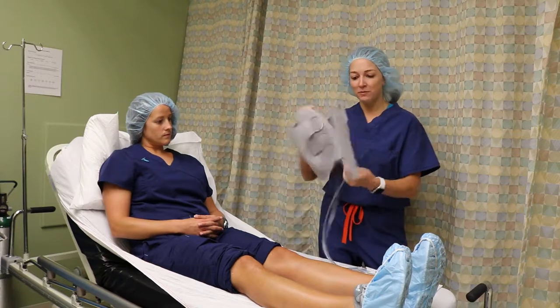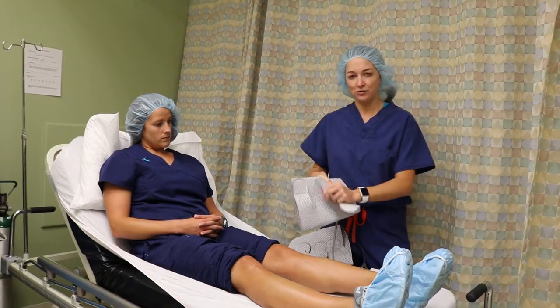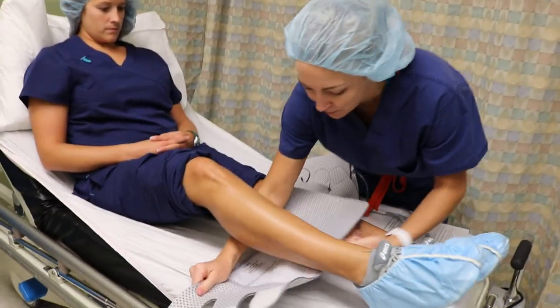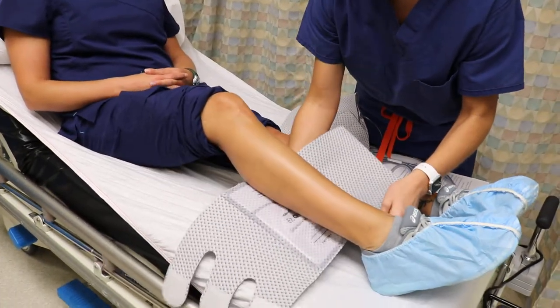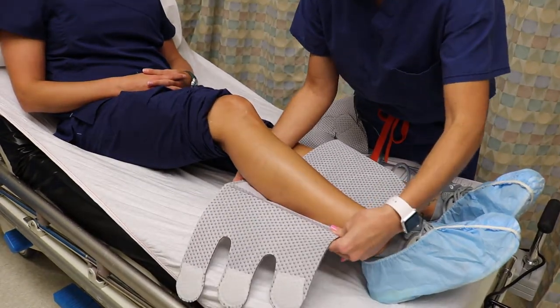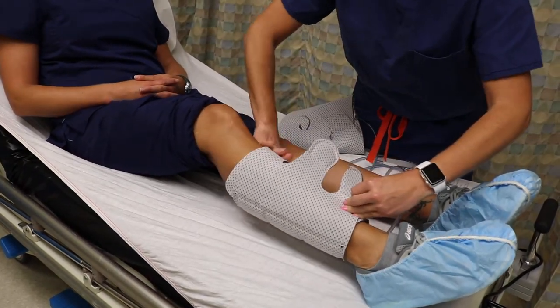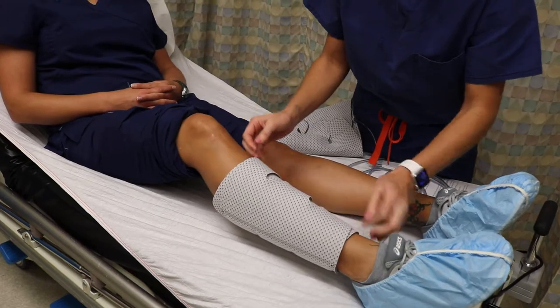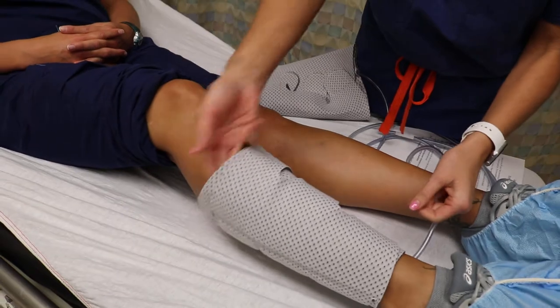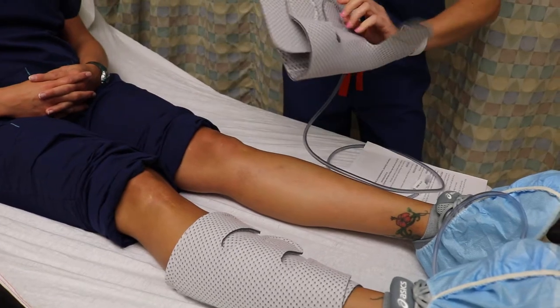It comes with two — does not matter which one goes on which leg. You simply un-Velcro the three Velcro tabs. You put the leg right on, calf up here — the wide part to the top of the calf, bottom towards the ankle — and you simply just wrap the sequential on the patient. You do not want to make it too tight, so a good finger width of wiggle room is perfect. You do the same for the other leg.